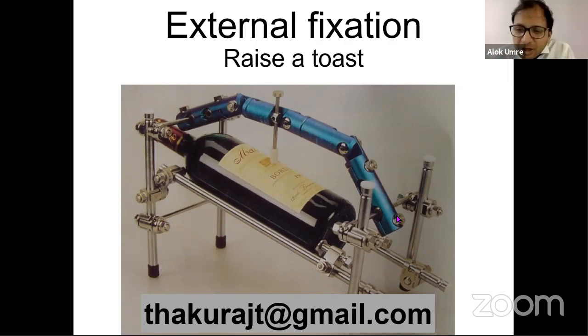Yes, sir. So there was a comment whether tincture benzoin, which you use around the pin, would cause collection underneath the skin, because it will seal the area. Tincture benzoin, the important point is relaxing the skin all around the pin, as Dr. Saxena just mentioned. When I pass the pins, I make sure that there is no tension in the skin anytime. And just to close that wound, I find tincture benzoin is very effective.